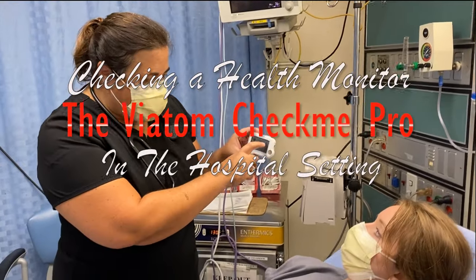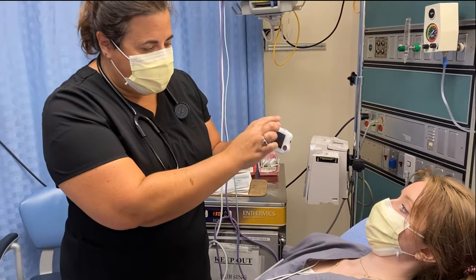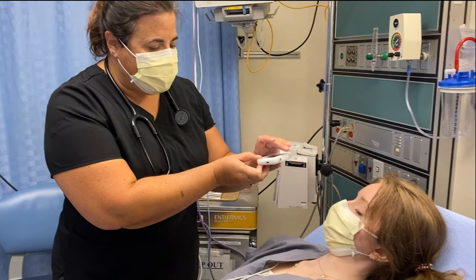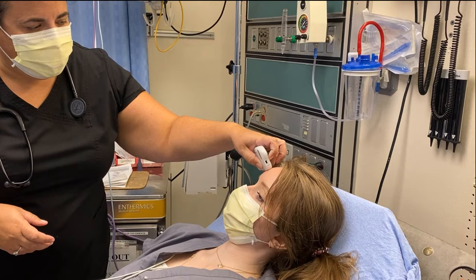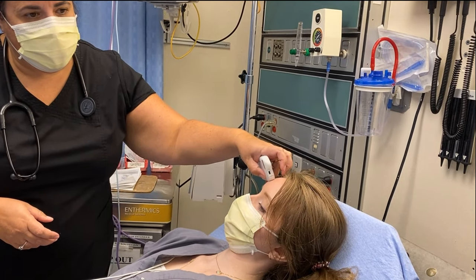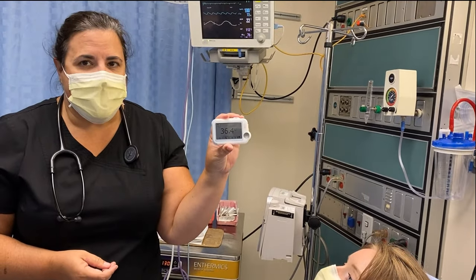So I'm going to have this little machine — you push the thermometer on the thing and then you clean the top with alcohol. We've already done that, and you push the air and follow directions. Click the home button, put it on her forehead, and wait for it. Her temp is 36.4. We know she doesn't have a fever, so it's pretty accurate.